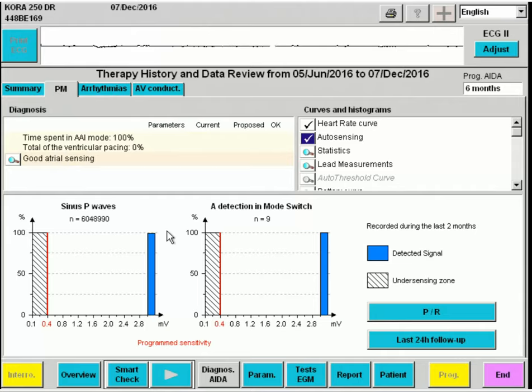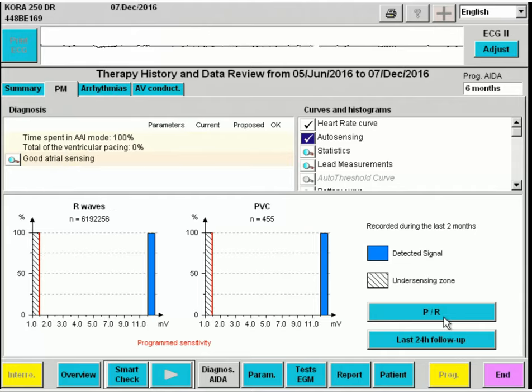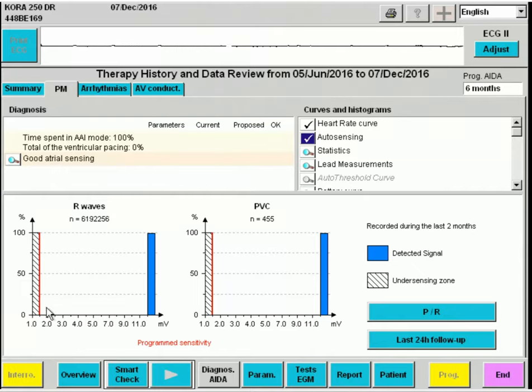The same for the ventricle — for intrinsic R waves and for premature ventricular complexes. Again, all events are sensed at amplitudes by far larger than the sensitivity.